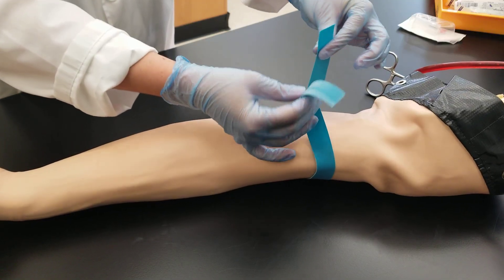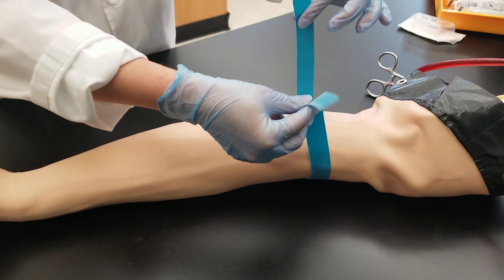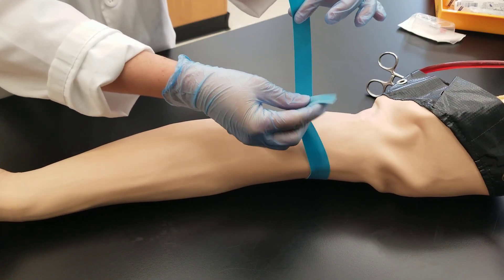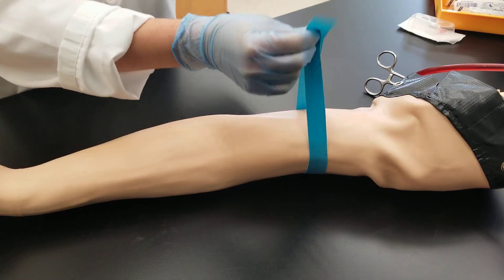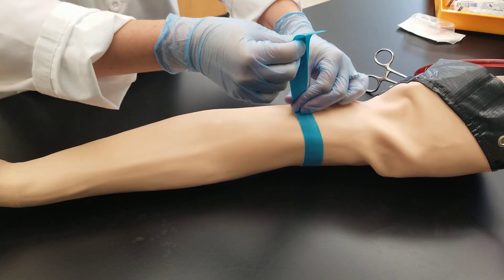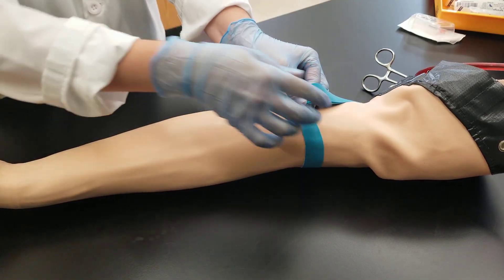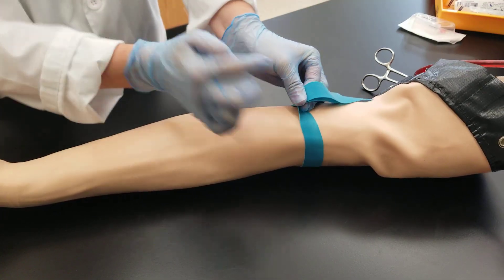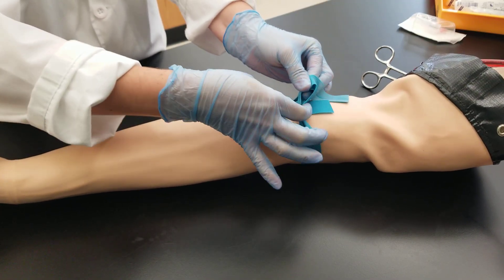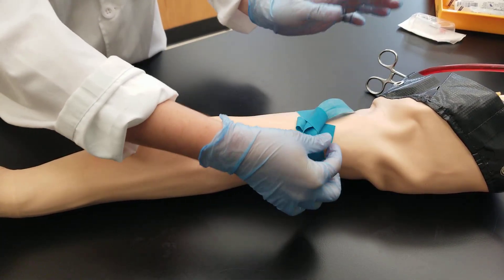What I'm going to do is lengthen the left side more so than the right side — that's just a personal preference, you don't have to do it that way, but I find it easier. So you pull both sides up taut, put them both in your right hand, then cinch down the bottom with your left hand. As you do that, you turn your fingers so that the left side ends up coming on top, and with your right hand you put the tourniquet underneath that side, which places your tails there.